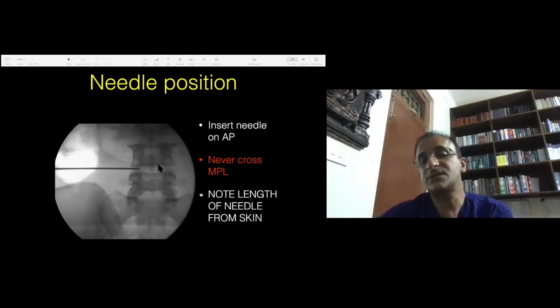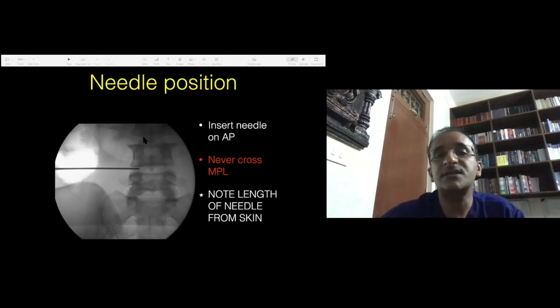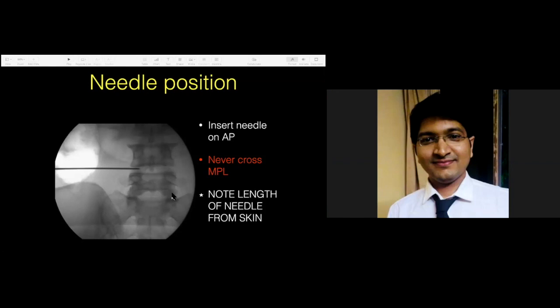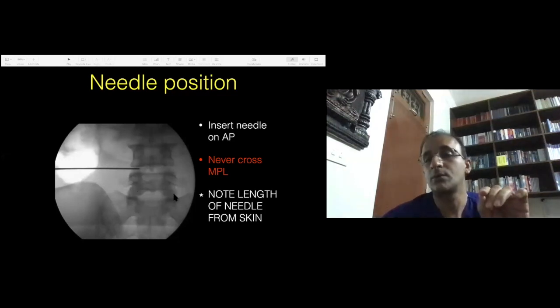See, here you see a single line. Here you see a single line. Just try to focus here. Here you see two lines. You understand? This is the end plate which is seen because of the angulation of the vertebra. This you don't want. Here, if you see the L5 vertebra, this is the anterior end plate, this is the posterior end plate. You see it like an oval structure? Yes, sir. You saw this, right? This is not an end-on view. This is with a parallax. These are not parallel. Here I have removed it. And how do you do that?